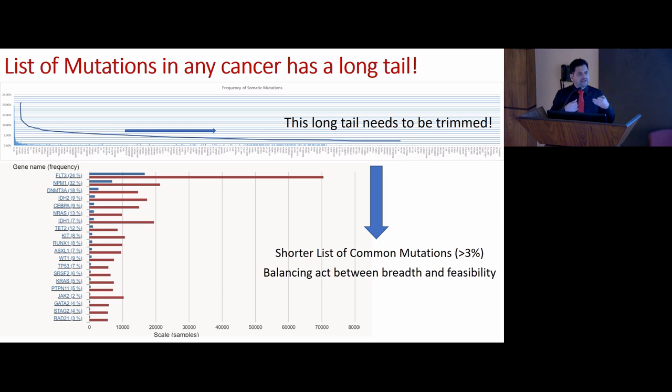So we have a 135 gene myeloid panel, which we think is apt. We made a mistake initially when we got a NextSeq; we went all out and made a 225 gene panel. It had all kinds of Fanconi genes and so on. We found one Fanconi anemia in 2 years. At the end of it, we realized this is nonsense. We are just wasting money unnecessarily sequencing all those. We are better off doing an exome in those patients anyway.